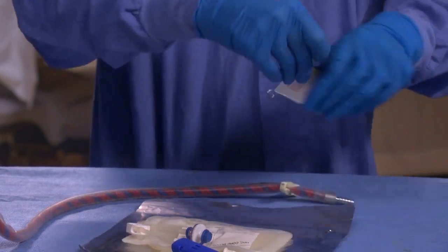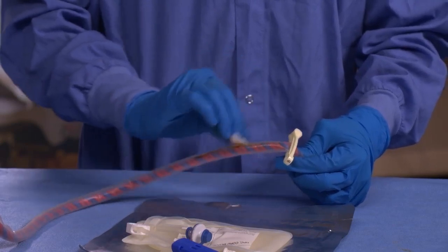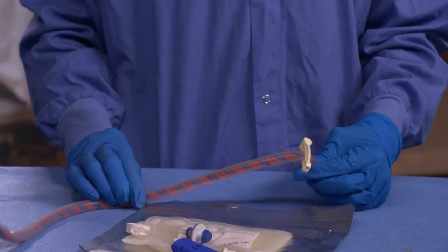Take a new sterile alcohol pad and wipe away any excess iodine. Once you have completed these steps, it is important not to touch the puncture site in order to keep it sterilized.